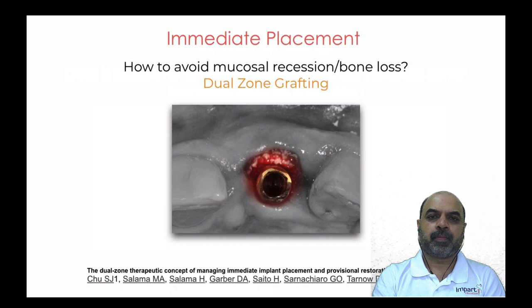The immediate implant placement, again, is an extremely popular way of rehabilitating patients who need extractions in the aesthetic zone, and over a period of time this has become extremely popular amongst clinicians. Also, from the point of view of the patient, patients really love it when you are able to combine two surgical procedures into one, which is to do the extraction as well as place the implant in the same surgical appointment.